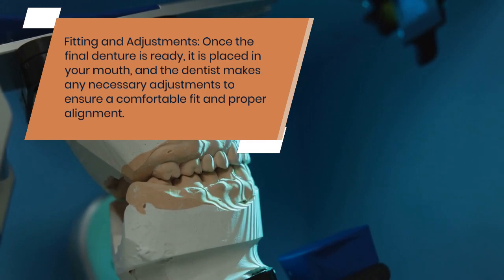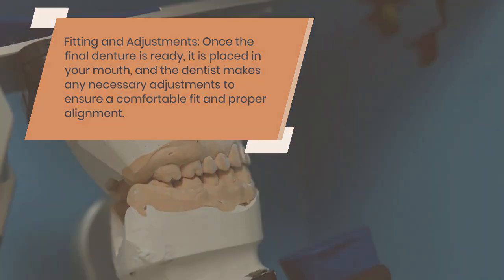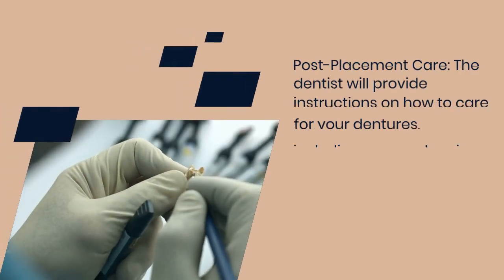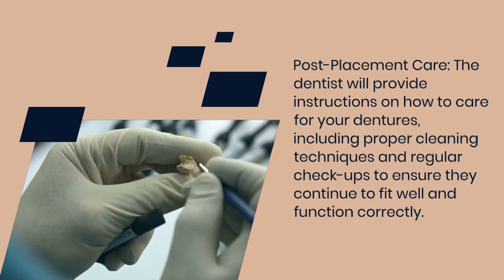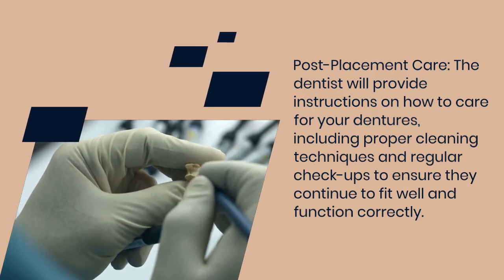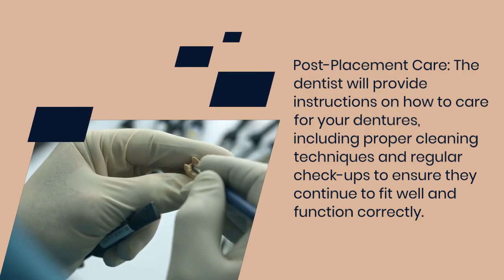dentist makes any necessary adjustments to ensure a comfortable fit and proper alignment. Post-placement care: the dentist will provide instructions on how to care for your dentures, including proper cleaning techniques and regular check-ups to ensure they continue to fit well and function correctly.